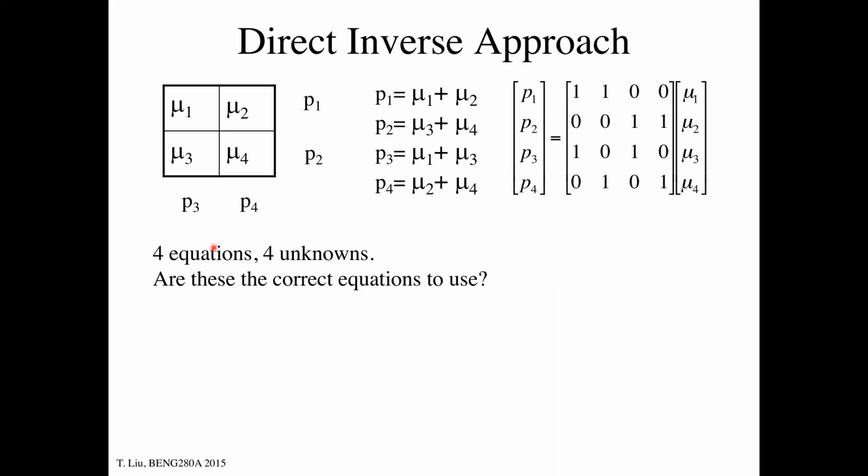Why would it be different from day to day? It's a good question. You should be asking yourself, why do you have to just buy the scanner and you should do the same thing every day? Not necessarily. If the voltage lags a little bit on the X-ray tube, right? Just like your oven, when you set your oven to 450 at home, but if we put in a thermometer, it's not going to be exactly 450.